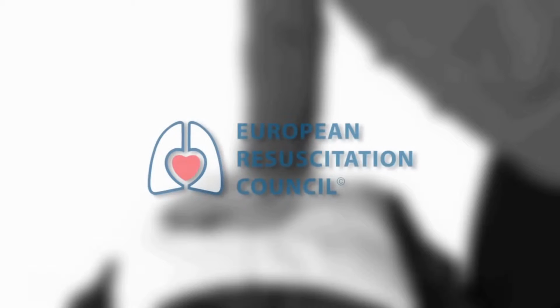Now that you have seen a demonstration of how to perform CPR and use an AED, we will go through the actions again, but this time I will explain what you should do.